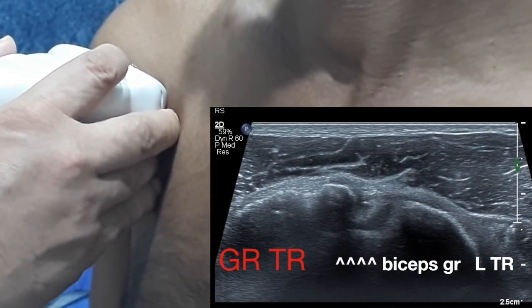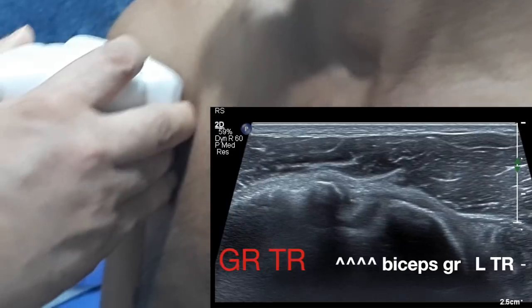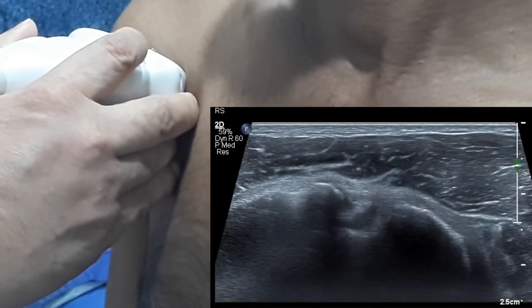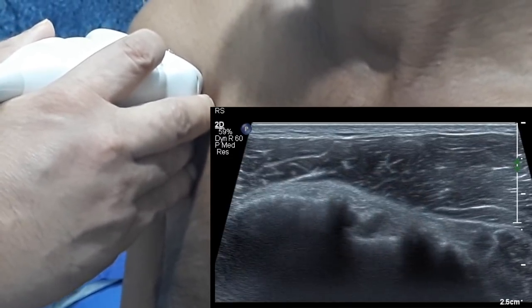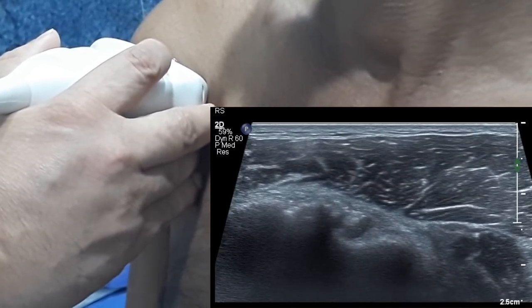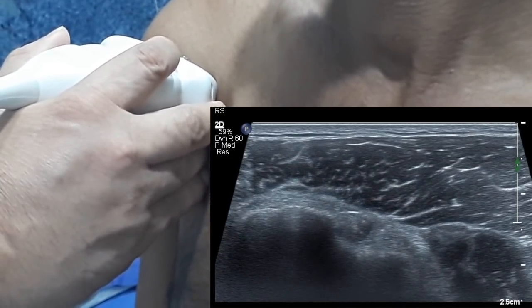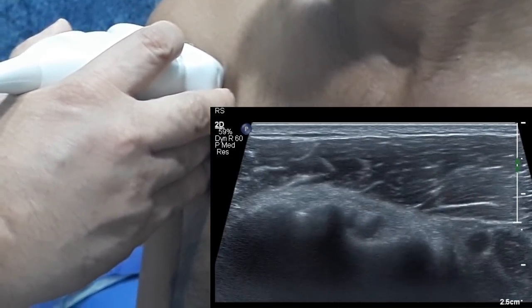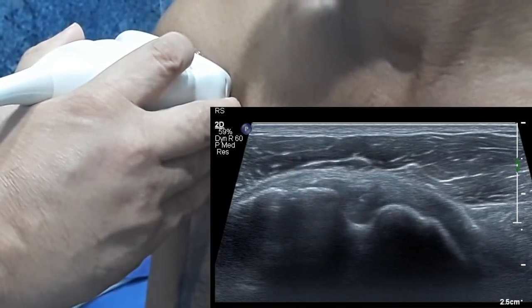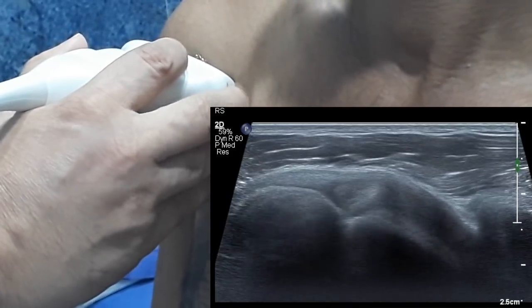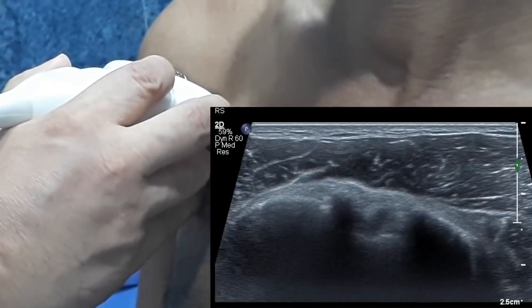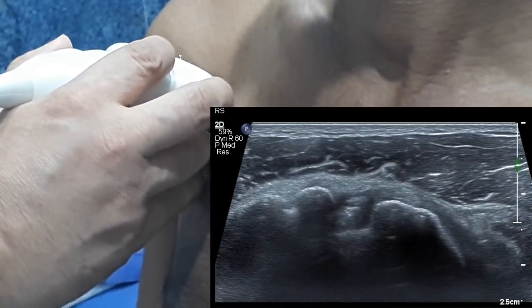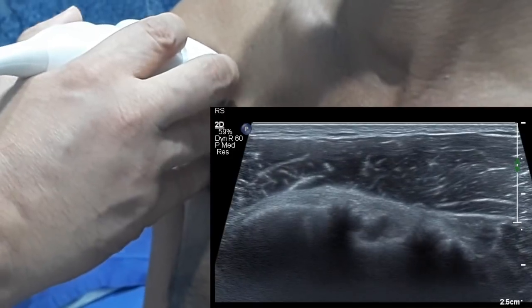Now if you see, as I move my probe from the superior to inferior aspect, the biceps tendon changes its echogenicity. At times it appears hypoechoic, and this is because of anisotropy.